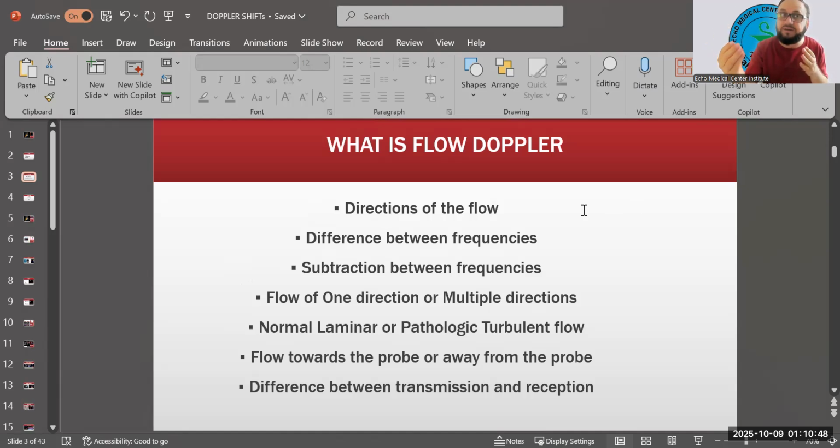It's not a reverse flow. It's not a retrograde flow. It's an antegrade, it's forward. It's not coming backward, so that is the normal direction of the flow. If we find the flow coming the back way, that's abnormal. So we want to know the direction of the flow. Is the flow normal in a vessel or abnormal?